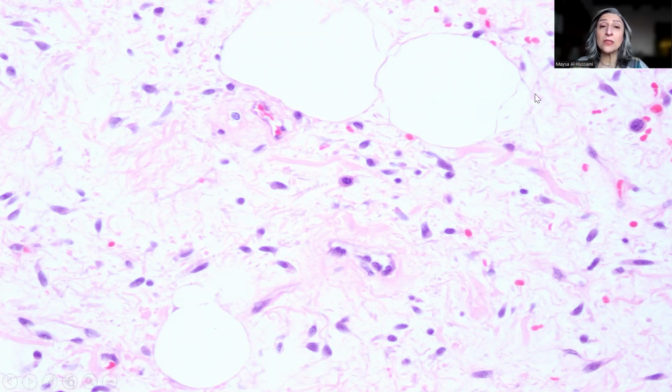We have a lipomatous component, we have the spindle cell as well as the stellate component, we have the ropy collagen, and we have the mast cells. These are the four components that are usually typically present in spindle cell lipoma, albeit in varying proportions. So some tumors would be really rich in fat, others would be fat poor, with the predominance of the spindle cell component and the ropy collagen. And here comes the difficulty in establishing the diagnosis.